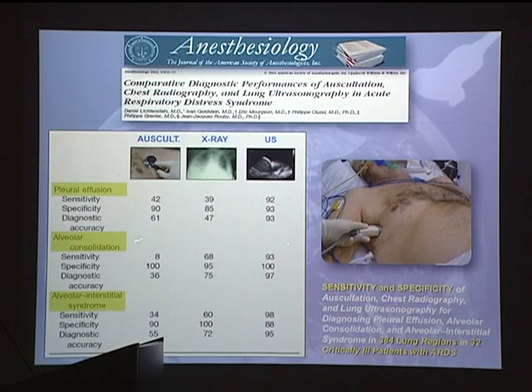But if you see the sensitivity, it's a disaster, because you see, for example, that among 100 patients with pleural effusion, 60% will be negative, false negative. Or with a stethoscope, 60% will be negative. What about, for example, pulmonary edema?